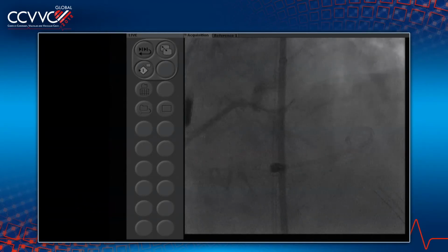Well, they say there's a lesion. I don't see the lesion in the LAD, but I'm told that there's an FFR positive lesion right across the diagonal in the LAD, correct? And we can see it. I don't know, how big was it by imaging with the OCT? You're going to give us all the data. Pretty big to me. So that's a little confusing to me.